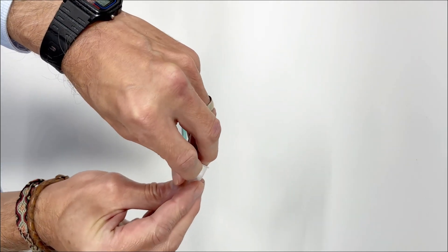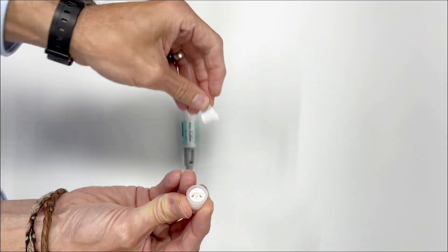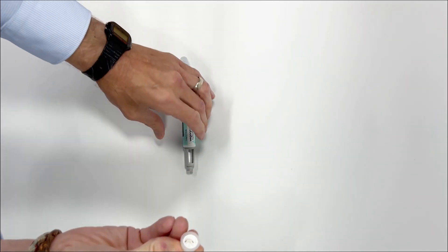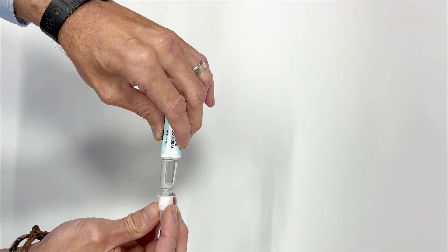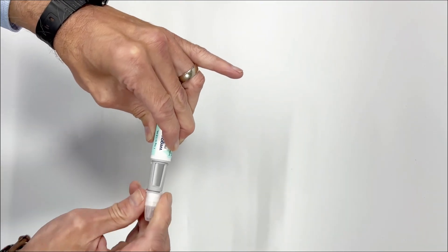Take one of the needles from the box and take off the seal. Push the needle straight into the pen, twisting until it is firmly in place.